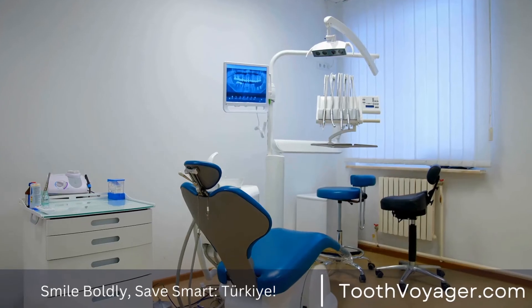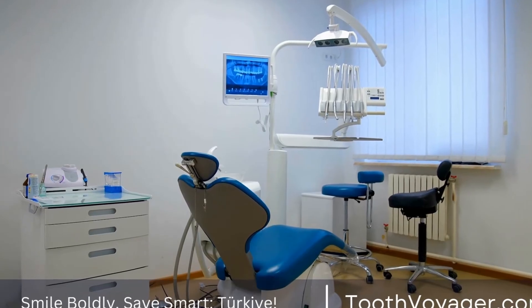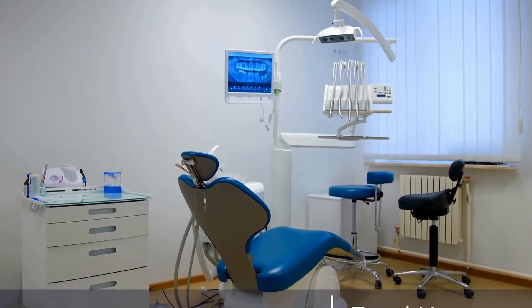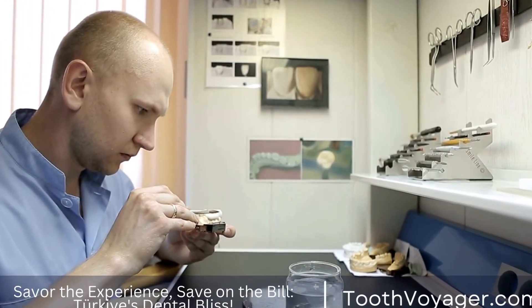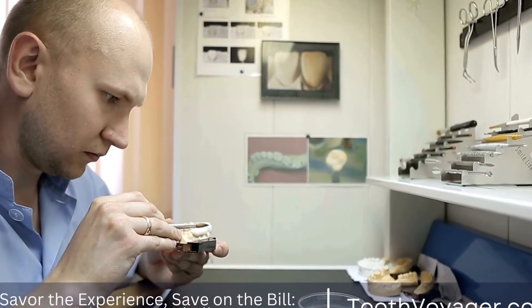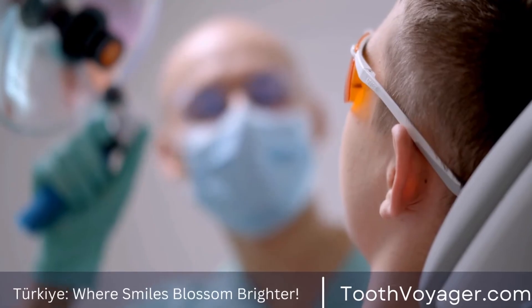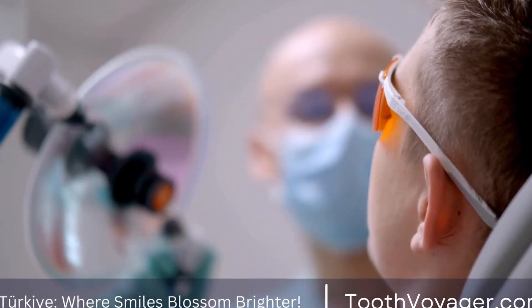A dental crown is a custom-made cap that is placed over the tooth to restore its shape, size, and function. Your dentist will take impressions of your tooth to create a custom crown that matches the color and shape of your natural teeth. The crown will be cemented in place to provide long-lasting protection for the tooth.